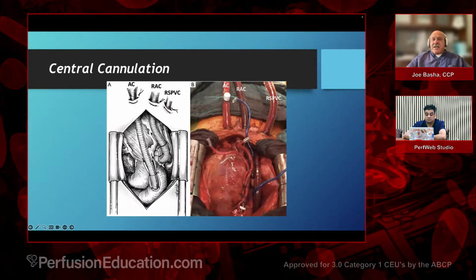Here is typical central cannulation. What I really want you to look at is how not only distended, because that's not all you see here. To my eyes, this is massive, massive cardiac edema. This patient is so incredibly fluid overloaded, and this is such an obvious illustration of that.